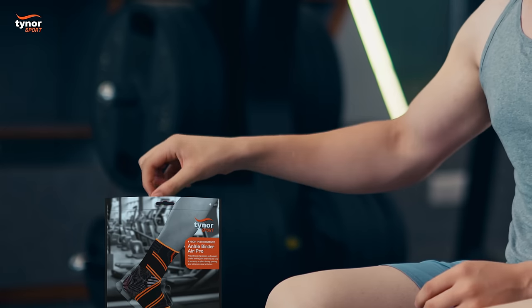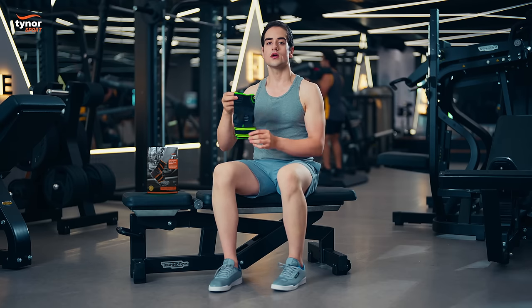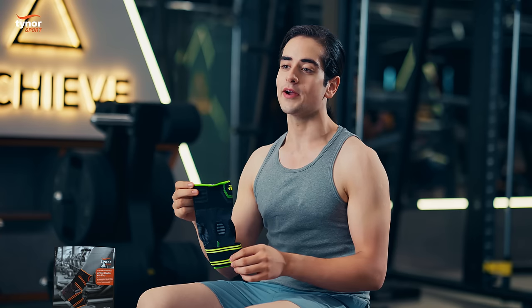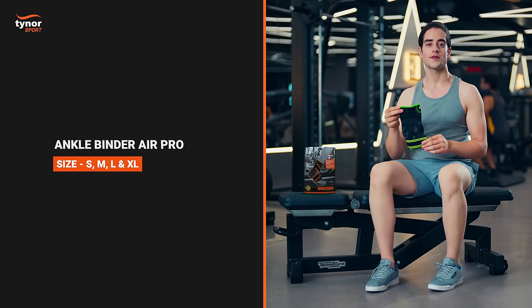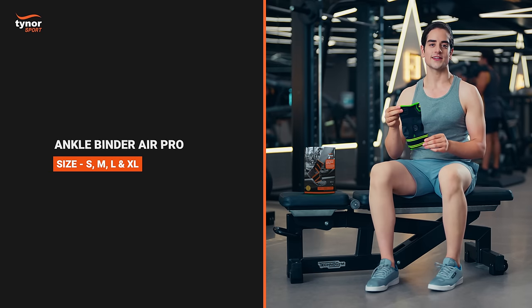Hi everyone. This is Tynor's Ankle Binder Air Pro. It comes in four different sizes: small, medium, large, and extra large.